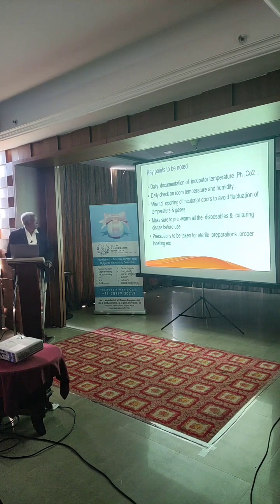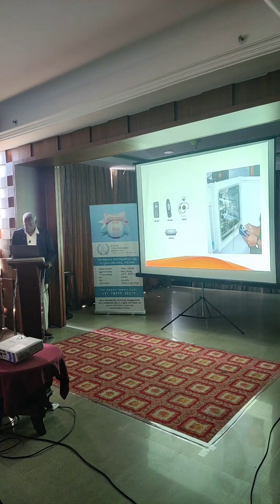So documentation is a very important aspect, and there should be minimum opening of doors for the embryologist so that you don't lose gas as well as the temperature. Make sure that these warmers are kept properly, and the culture dishes, all the plasticware that we use, have to be properly checked and pre-warmed before we use the materials in the lab.